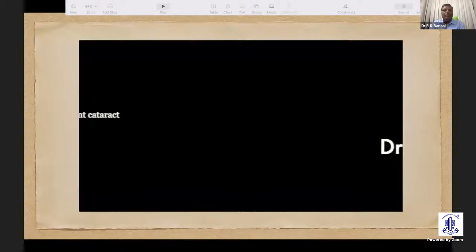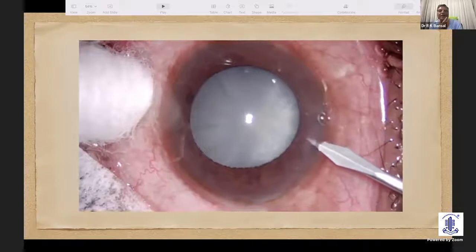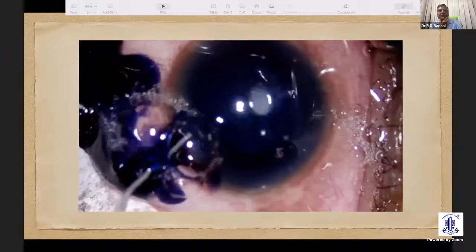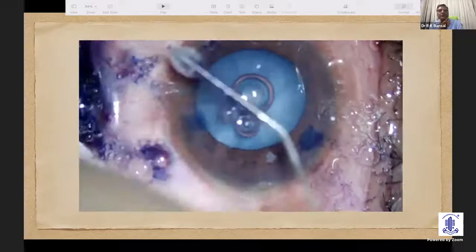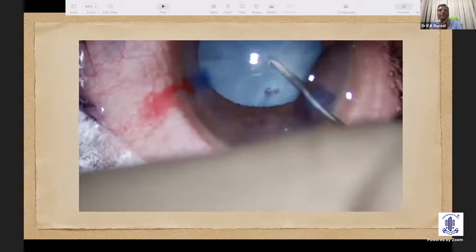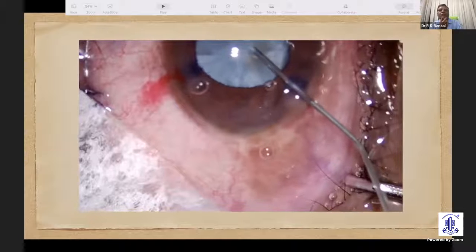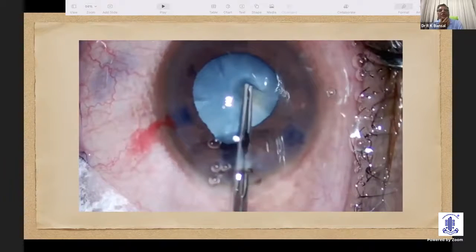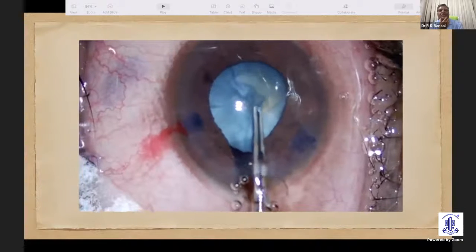All of us face this problem many times during cataract surgery. The patient comes late and there is already a swollen mature cataract, as you can see in this video. There is a necessity to stain the capsule because there is no red reflex in these patients. So, trypan blue was used to stain the capsule, and then a high-viscosity viscoelastic was used to push the capsule back. Just when I puncture, there is a leak of liquid material. One can aspirate the cortical matter to bring the intralenticular pressure down. I was confident this patient could have a good capsular rexis, so I started with a capsular rexis using capsular forceps.